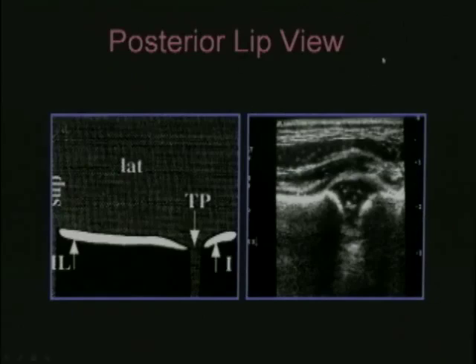If you can't reduce the hip sonographically and demonstrate that, then it is very likely that using a conservative type of harness or brace is not going to be successful, and that surgical treatment is necessary.